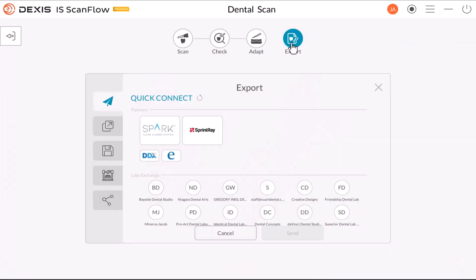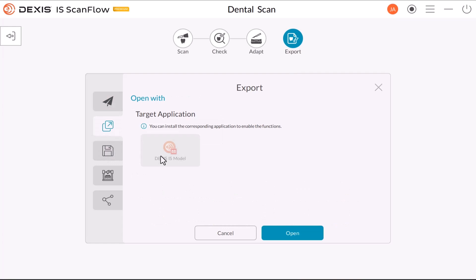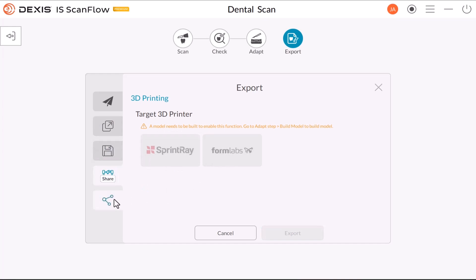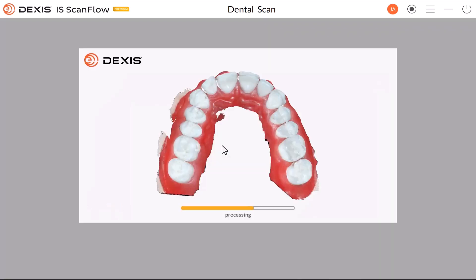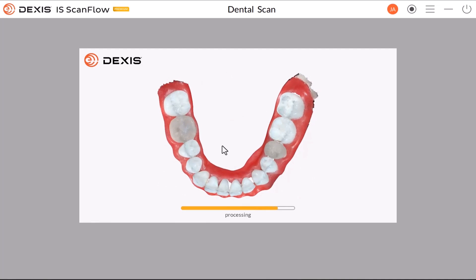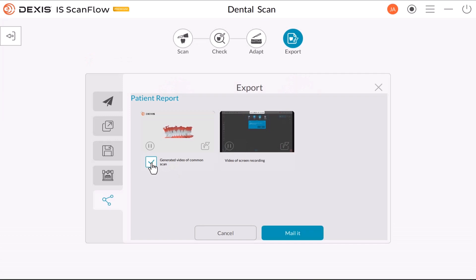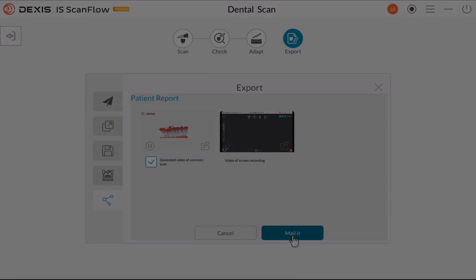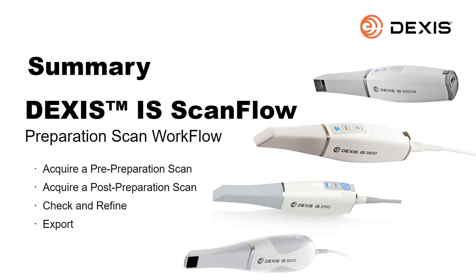Click export. In the export section, you can send the scan to a partner or lab. You can open the file with additional software. You can save the file on your computer. Premium users can use the patient report feature to email a patient report, which can include both an animated digital impression and a quadrant snapshot report. After choosing what you would like to email, click mail it. This concludes DEXIS IS ScanFlow Preparation Scan Workflow Recorded Class. This episode can be searched by 610-XU.